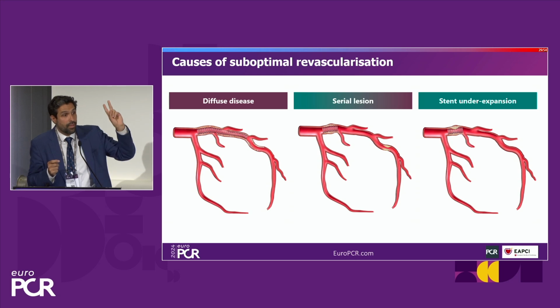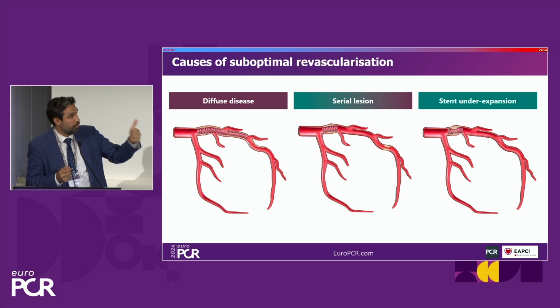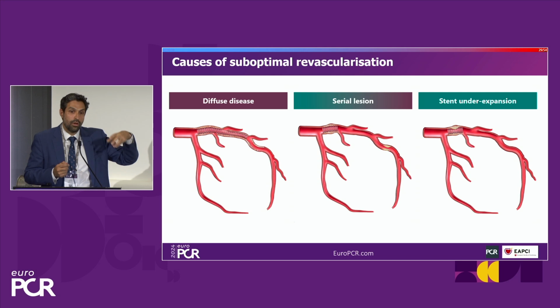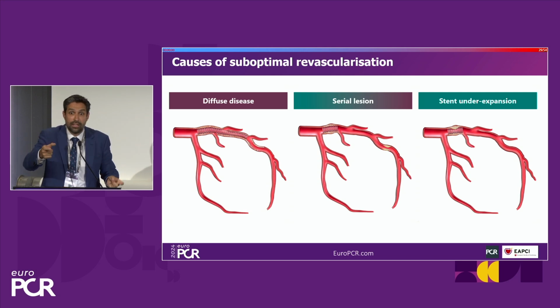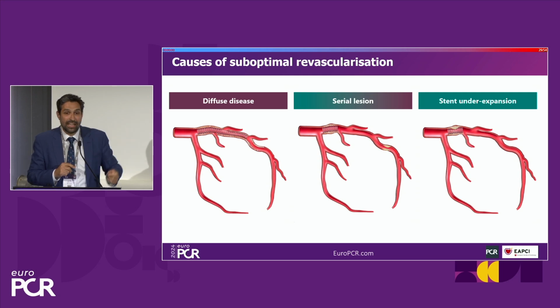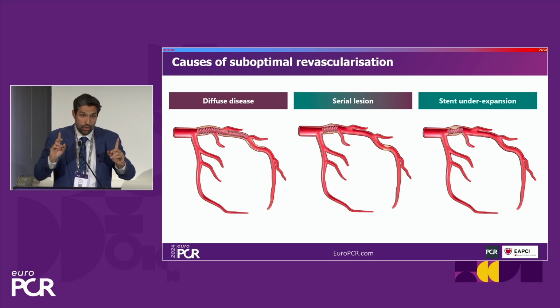But there are two scenarios when you can do additional maneuvers that we believe are going to be associated with improved outcomes. The first one is the fact that after treating one lesion, you can unmask the contribution of the distal lesion and understand whether an additional stent is needed or not. And the second part is something that we're using as well, and Jessica has shown beautiful cases about this, is that sometimes when you have severe stent underexpansion, you can look at the translesional stent gradient with physiology and just optimize stent implantation on physiological grounds.